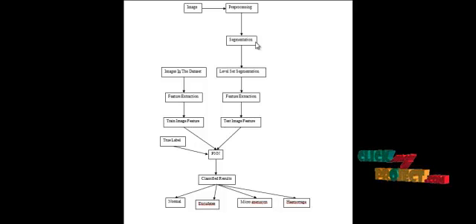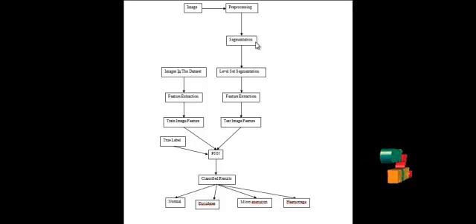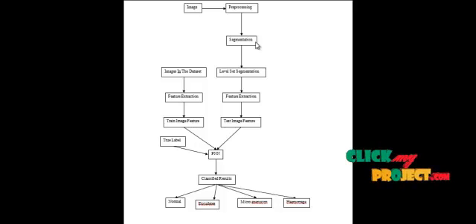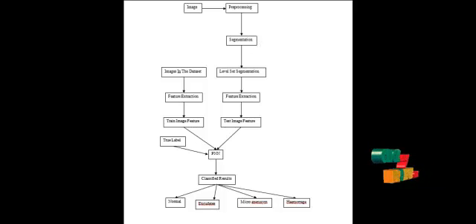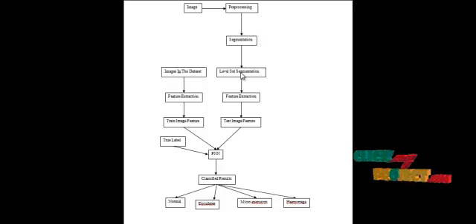Normalization of the images involves adding the average value of the color channels to each color channel. This results in an increase in the contrast of the retinal image, which clearly identifies the bright pixels in the image. Finally the color channels are combined so that the images are ready for further processing.